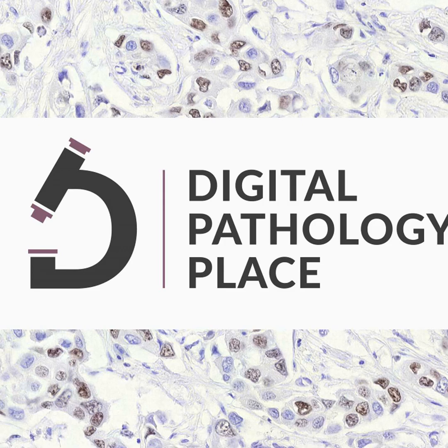Normally, the first approach for training models, and it still is the approach for training those foundation models, you aggregate your data. In pathology, it's going to be slides and reports and different things that go with the image data. If it's a multimodal model, sometimes it's only vision. When it's text and vision, you can have multimodality. And of course, we're striving for even more multimodality across different medical specialties. But normally you aggregate, and that is the problem because you get all the data together, all the information is together, and this can be done within one institution.